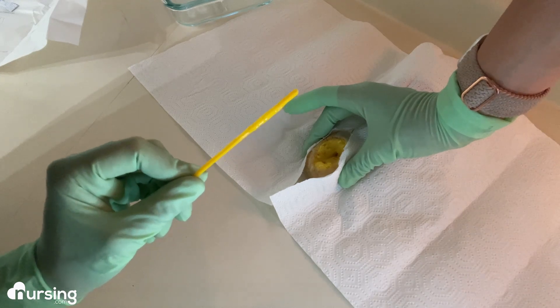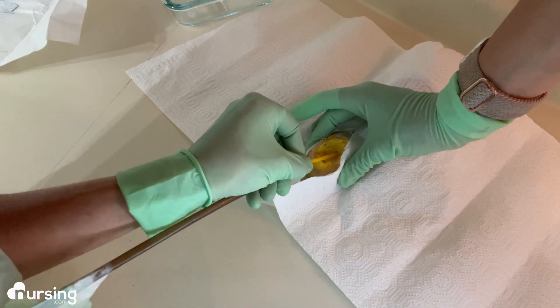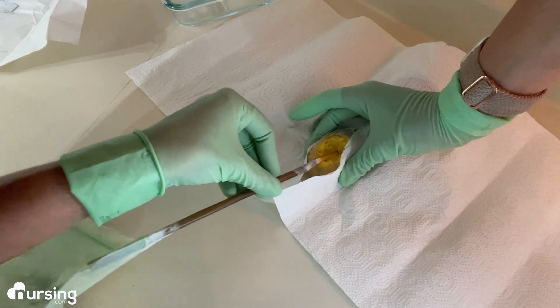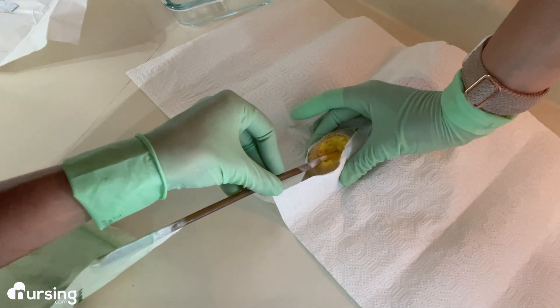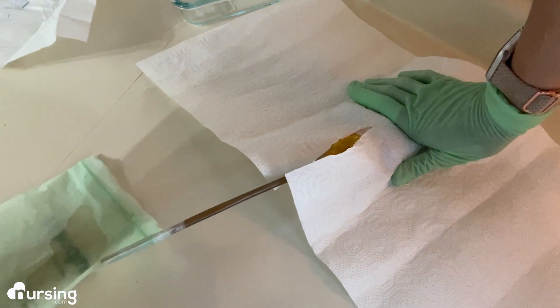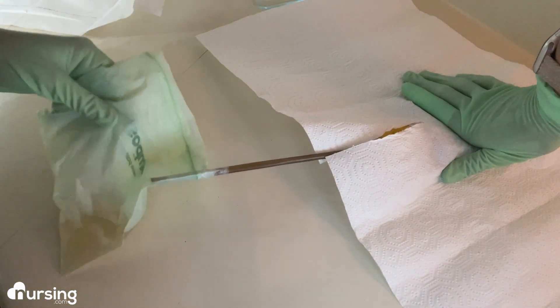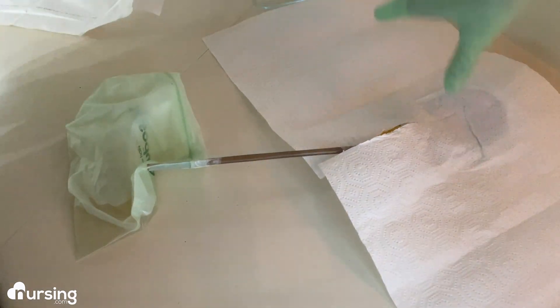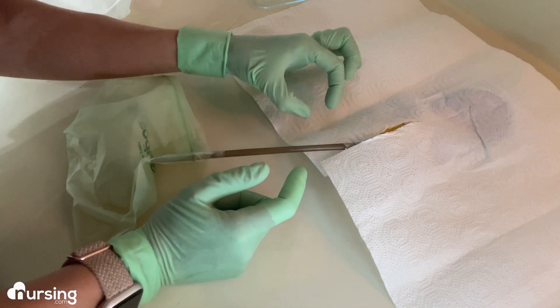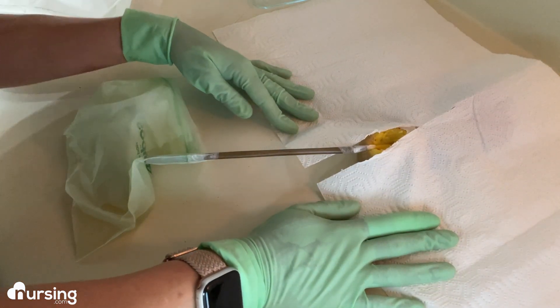Now I've got my lubricated catheter tip and I'm going to insert it into the urethra. If I'm in the right spot, I'm going to get return into the catheter bag. You might meet just a little bit of resistance, then go a little bit more until you kind of hit, then retract just a little bit, and you should get return into your Foley bag. I am indeed in my bladder — which is the Capri Sun — and I've begun to collect the urine. Then you're going to secure the catheter tubing to the patient's leg with a securement device, making sure that gets changed and maintained properly to avoid catheter-associated UTIs.